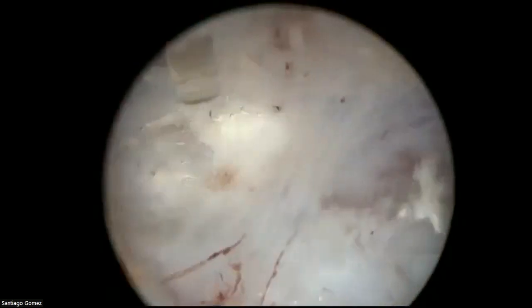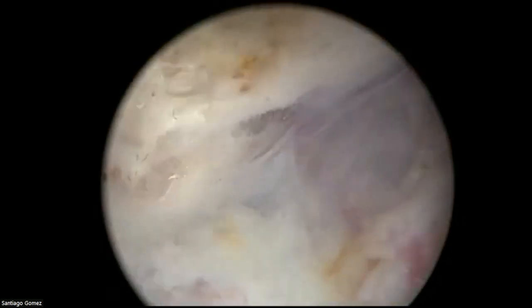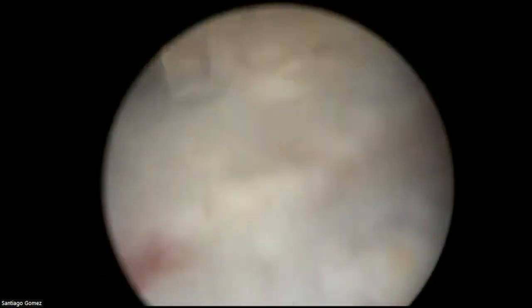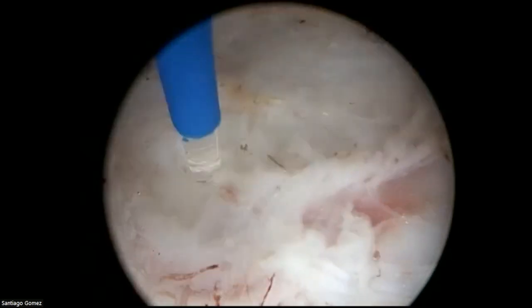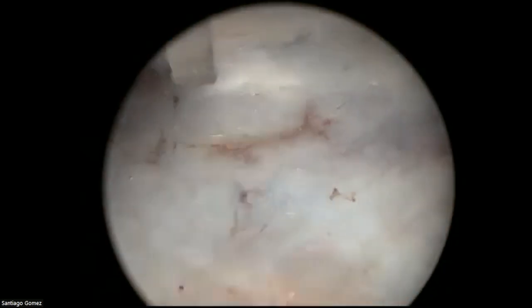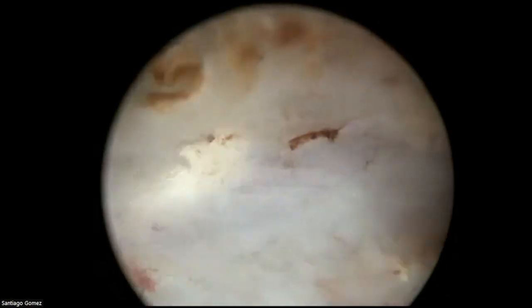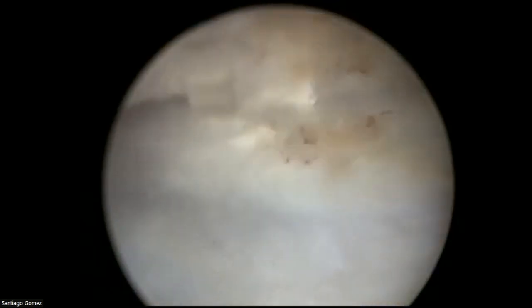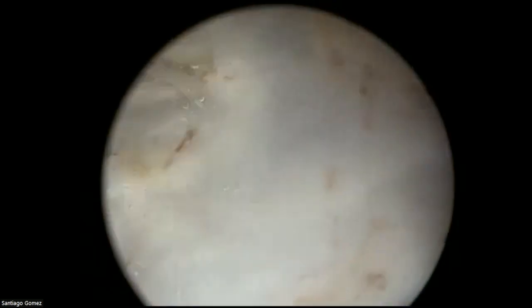So this is, I think, the most important single thing that you have to know. Aiming is fundamental, you know? If we are here and you fire here, you will perforate the capsule. But if you fire up here, you see, you will develop the plane. Very simple concept, very easy to learn, and very easy to execute.